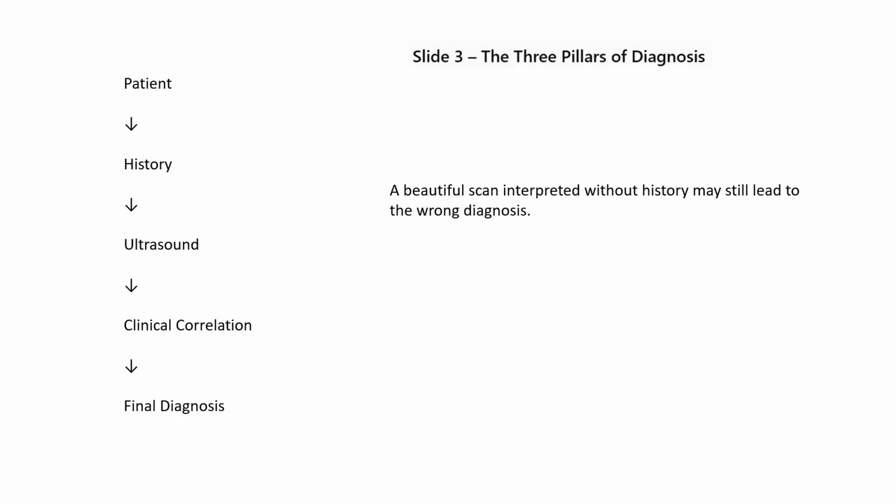Now, the three pillars of diagnosis, what are they? The patient history, ultrasound, clinical correlation, and then the final diagnosis. A beautiful scan interpreted without history may still lead us to a wrong diagnosis. Even a very beautiful ultrasound scan interpreted without history might lead us to a misdiagnosis.